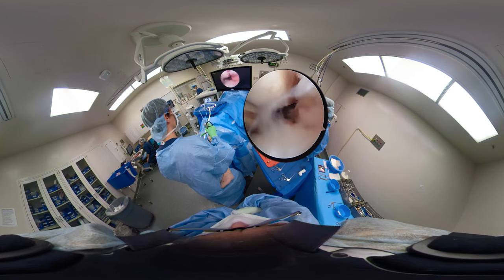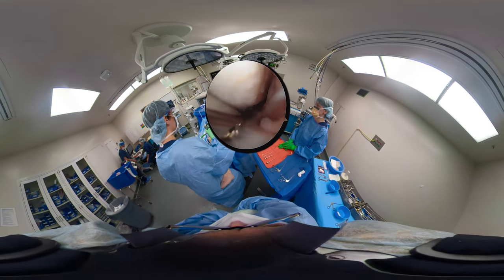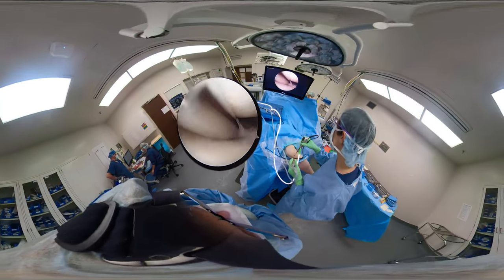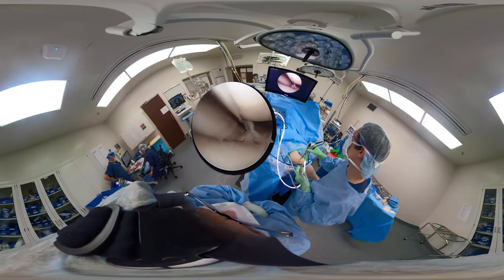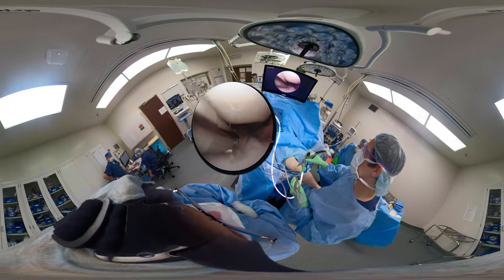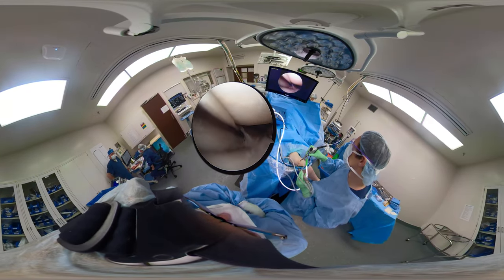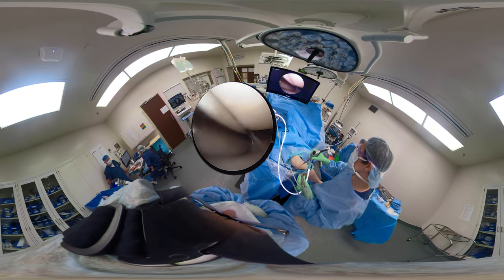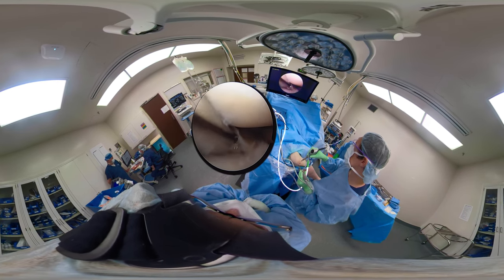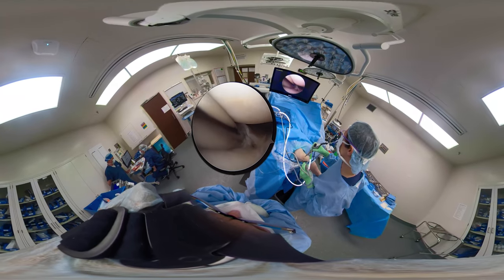Now we have a curved motorized shaver — this one is a 3.5, and this one is a 4.5; they come in several different sizes. As you can see, he's in more valgus, supplying more valgus so we have a better opening and better access to that posterior third of the medial meniscus. The shaver blade is on the torn meniscus, not on the articular cartilage. In some of these tears that are chronic, using your shaver can better define the tear pattern. Typically it's the tibial side that's the unstable side.